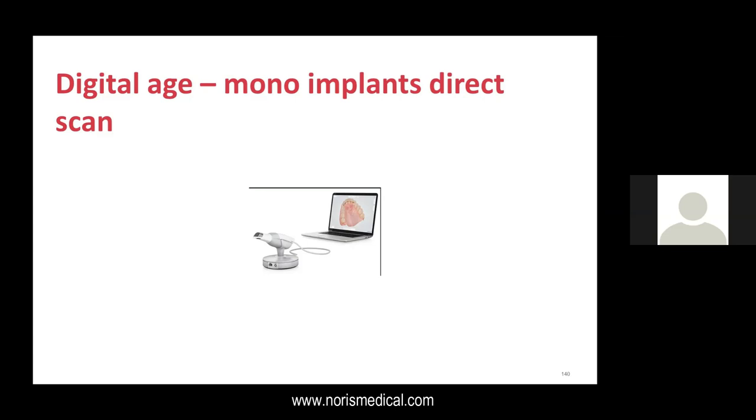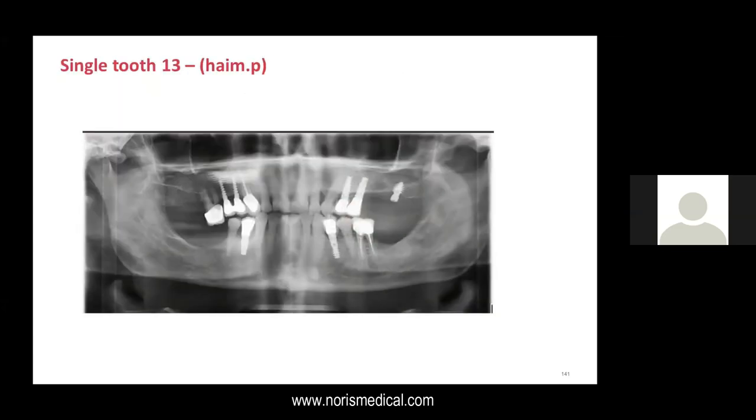Now I can show you how I do the cases very easily: extract the tooth, do the implants, bend them, and then I scan it. It takes not more than 5 minutes. After 45 minutes, the patient gets from a printer a final bridge. I'm lucky enough that my technician is a 5 minute walk from me, so she does all the printing work. But I think I can say that this is an immediate loading in an hour. So I'll show you some cases and share with you my joy, and then I will answer your questions.